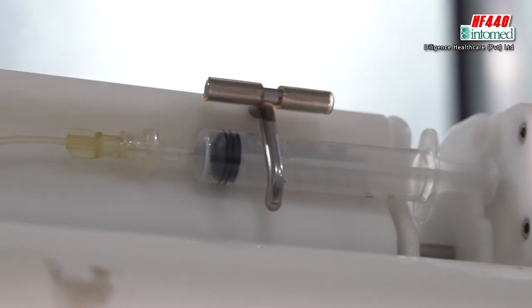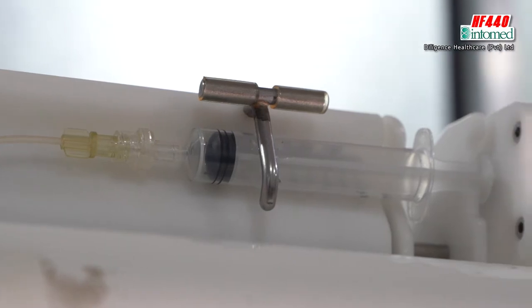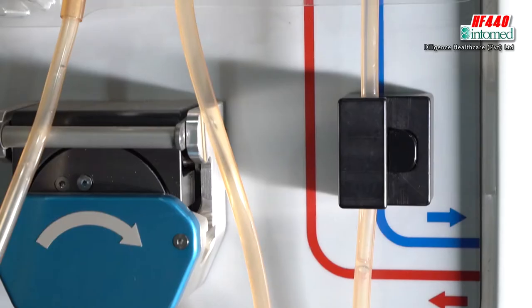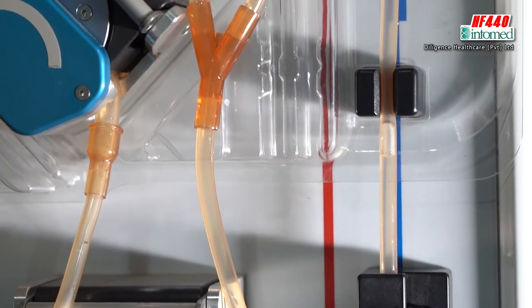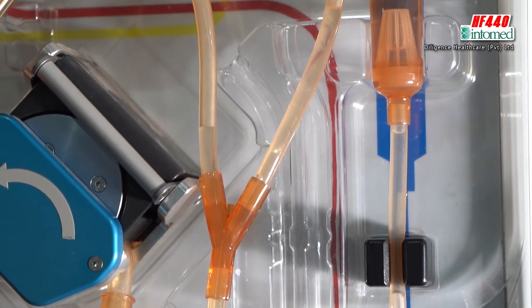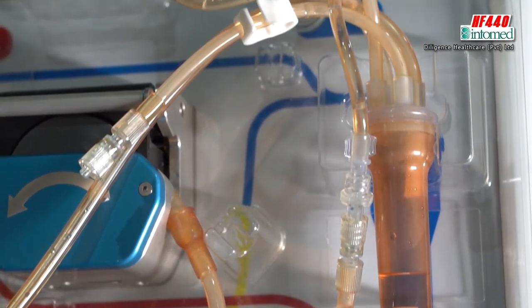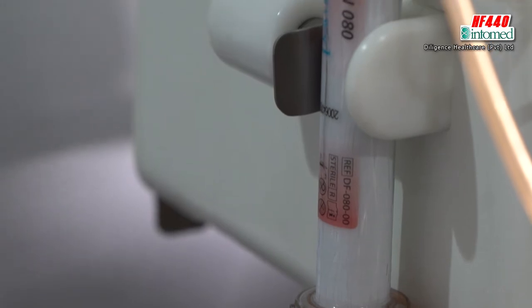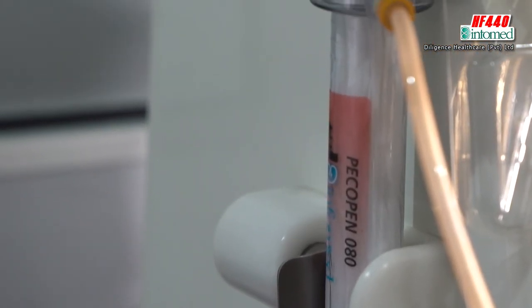Then you have to check for about 10 minutes whether the patient's blood pressure will go down or not. If the patient is stable, increase the blood pump up to about 60, 65, or 70. Then again check for about another 10 minutes — you have to be vigilant. If the patient is okay and blood pressure doesn't go down, increase the blood pump up to 100 or 110.